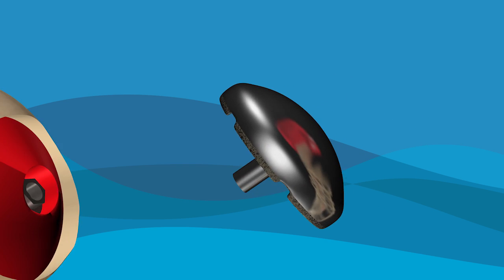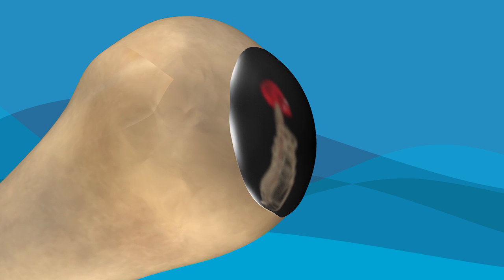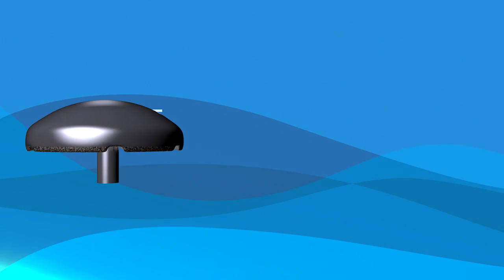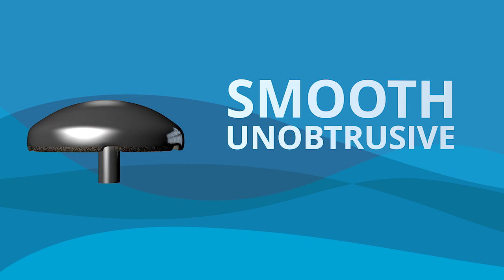The final metal implant is then placed and locked into the screw, completing the procedure. Because the Hemicap Implant System is designed to match the exact curvatures of your joint surface, the final implant is smooth, unobtrusive, and strong.